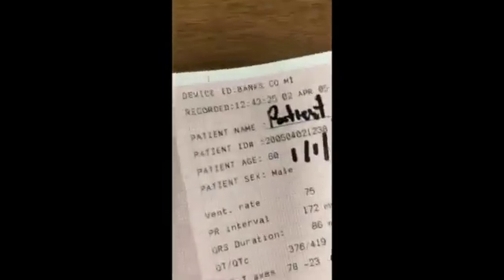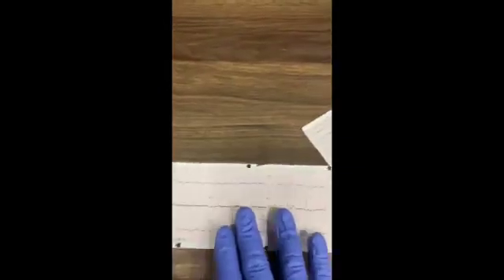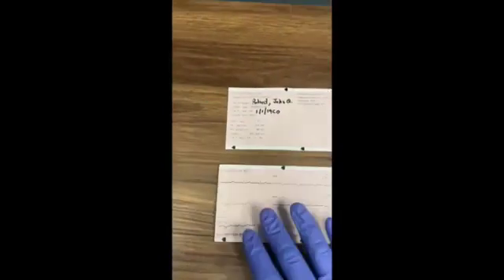3. Launch the Camera app on the Surface Pro. Hold the Surface Pro flat and level, parallel above the ECG. Capture the photo at approximately 18 to 24 inches above. 4. Photograph the ECG record, then tap the Photo Preview icon in the bottom right corner of the screen.